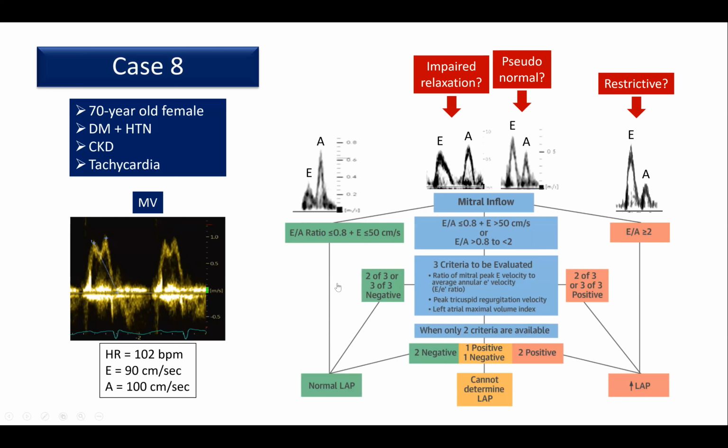And particularly a diastolic stress echo, if you really cannot explain the dyspnea on exertion based on your resting echo, and many times you cannot. And as I mentioned earlier, many times your patient has normal ejection fraction, a normal pro-BNP and normal filling pressure at rest. The diastolic stress echo is the only way to get to the cause of your patient's symptoms.